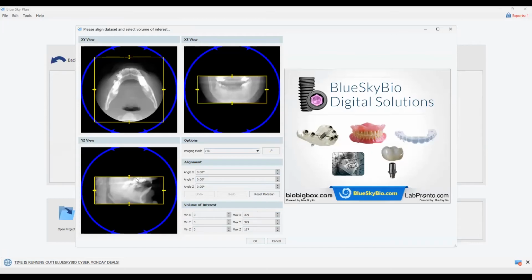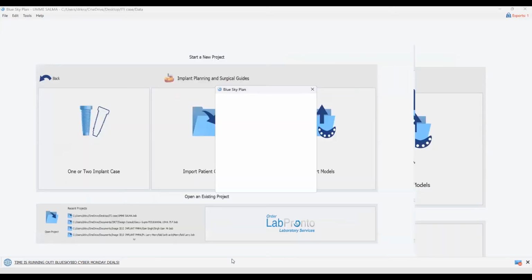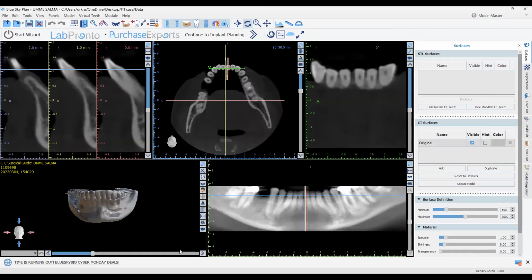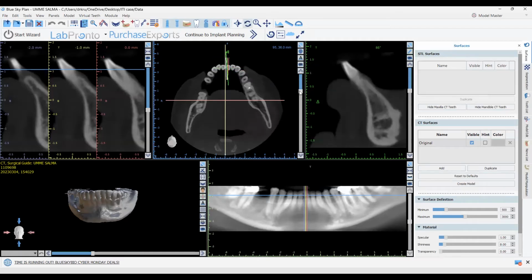So this is how the view is seen. So I'm going to cut down what is unnecessary data. What is only required, I'm going to keep that. So this is the opening window, what we saw there, same it is. Once that is opened, we can toggle this, and this is the axial view.